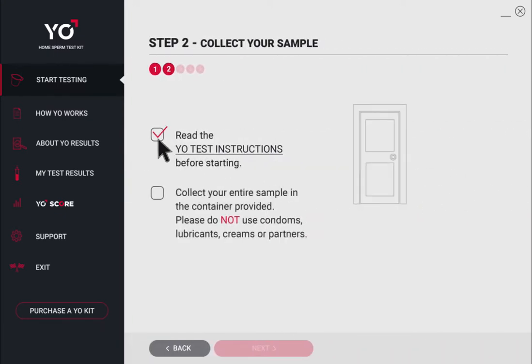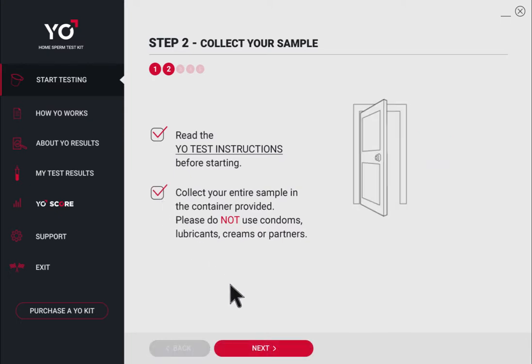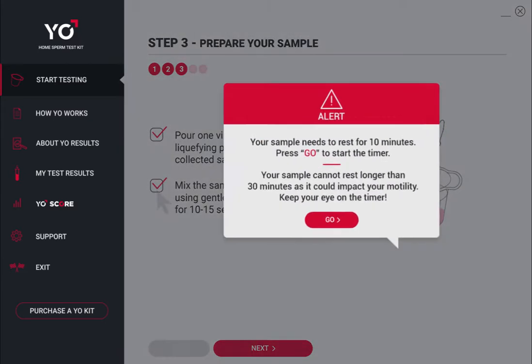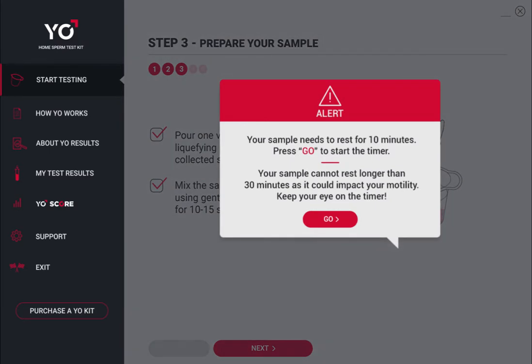Collect your sample, but please don't use any lubricants, creams, condoms, or partners. Pour the liquefying powder into your sample — your sample will turn pink. Let your sperm rest for 10 minutes.